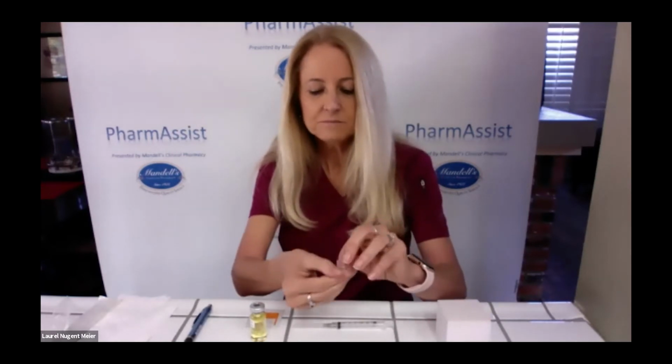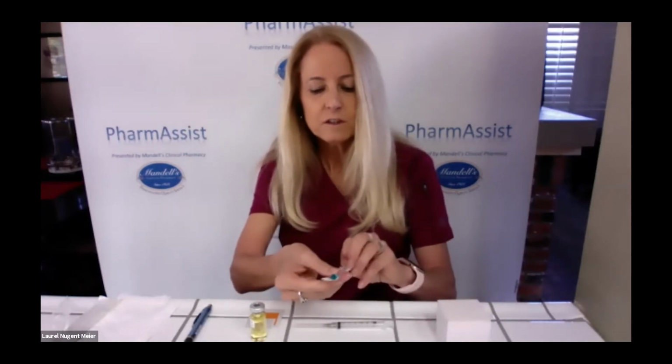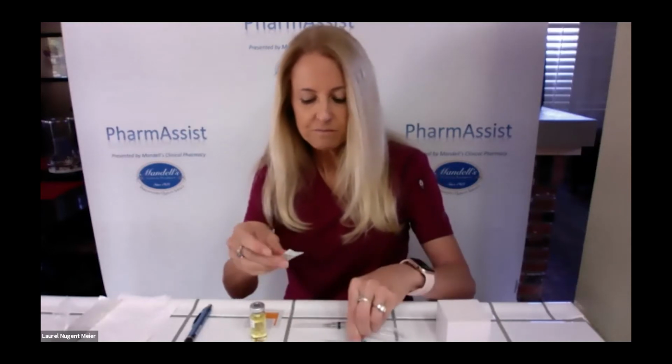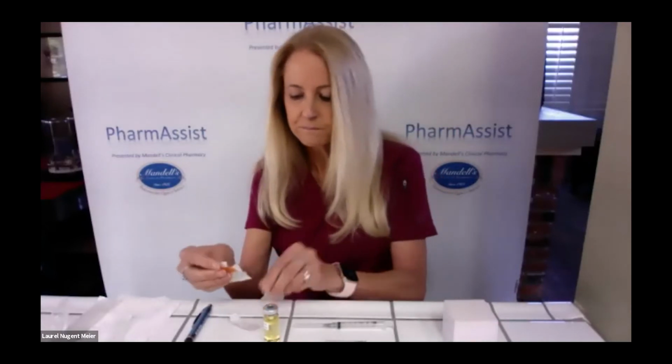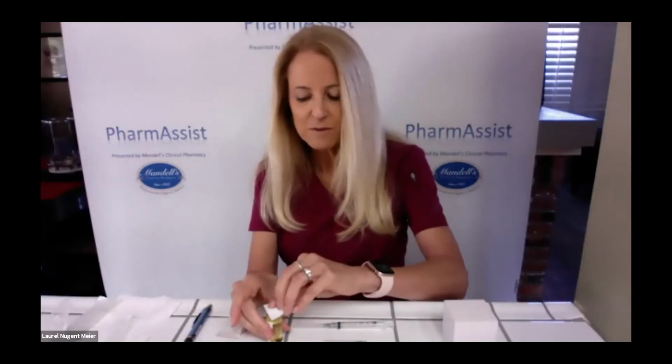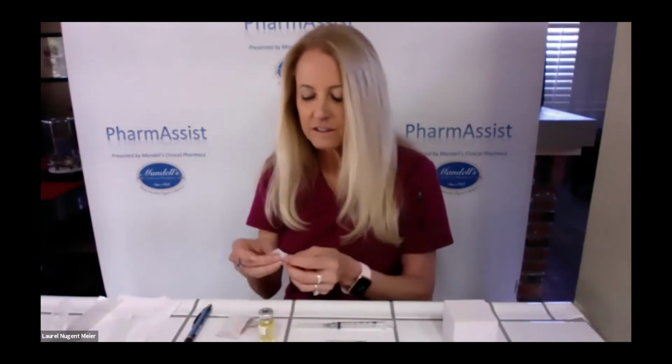So twist it on, open up your other needle, which is for giving your progesterone. Open up your progesterone in oil, and then you have your alcohol wipe. Always alcohol the top of your progesterone before you get started. Make sure you've washed your hands and that you've dried them thoroughly.